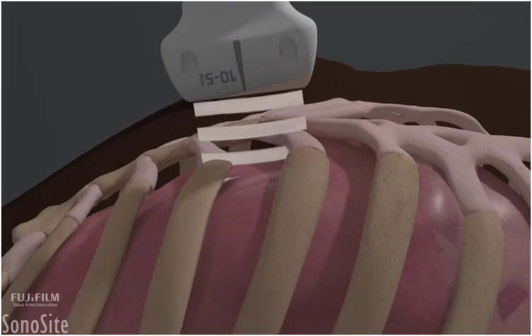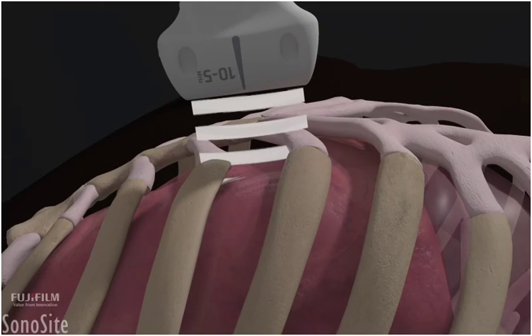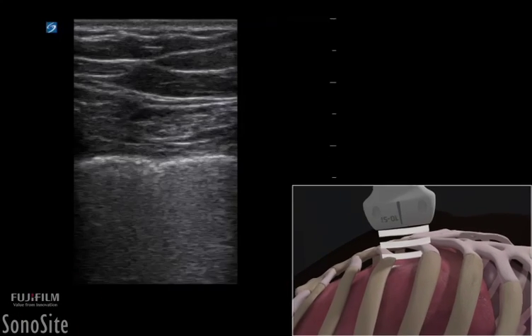The linear transducer is placed in the most anterior aspects of the patient in the supine position, traditionally working in a cephalad to caudad direction at the midclavicular line at the second or third rib spaces to the anterior axillary line at the base of the thorax. The indicator should be at the 12 o'clock position throughout the scan. A view of the ribs is key to correctly identify the lung pleura that resides just below.